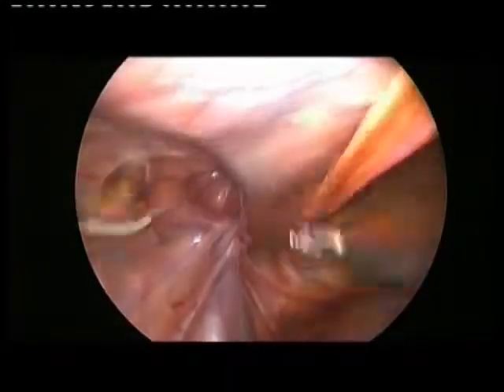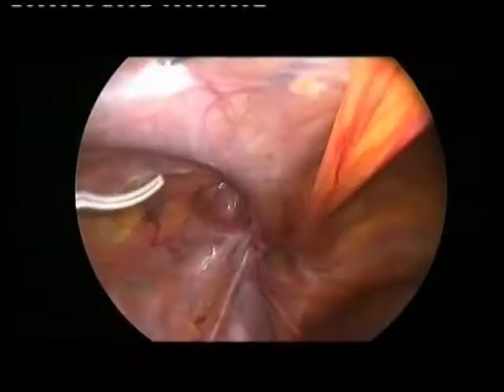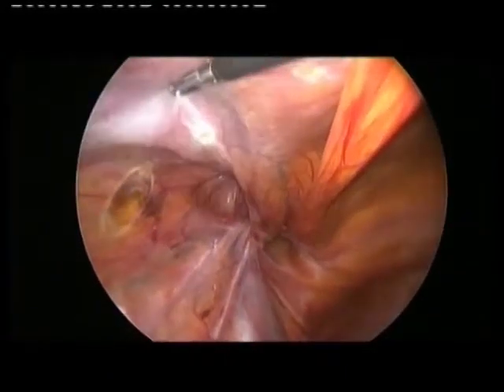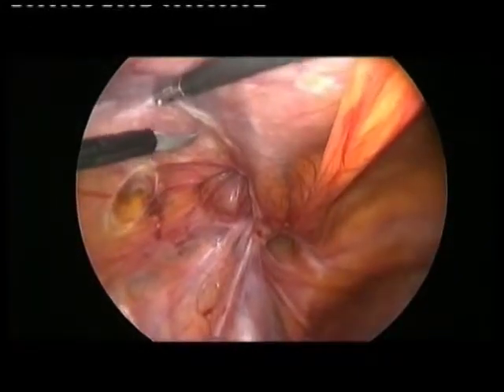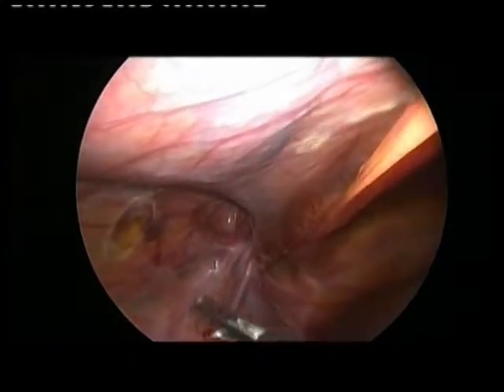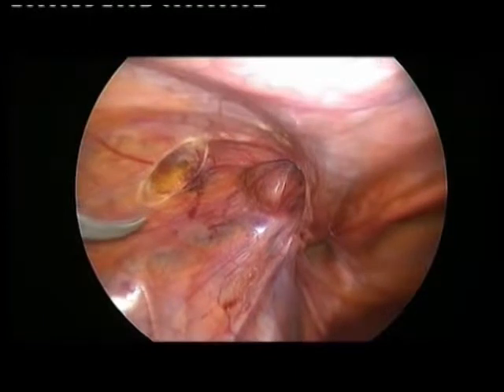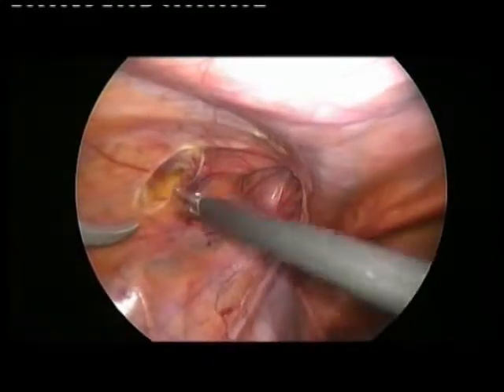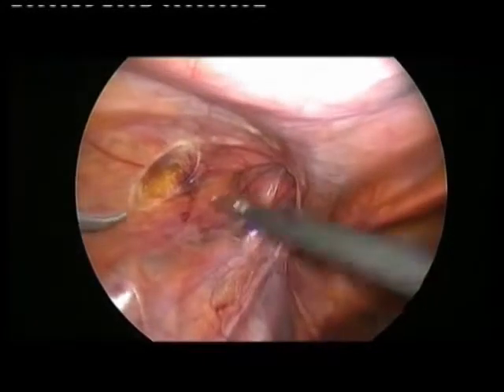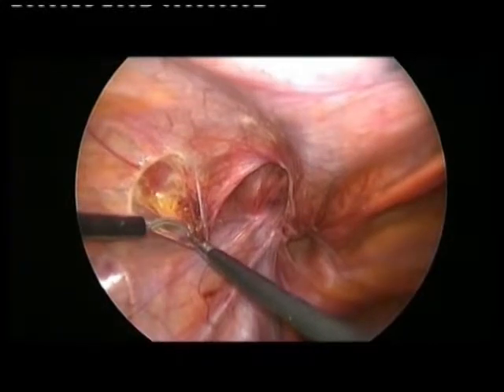And now I'm using an 8 French piece of a stent, so I know which is my lumen. And now I have 2 stitches proximal and 1 stitch distal.